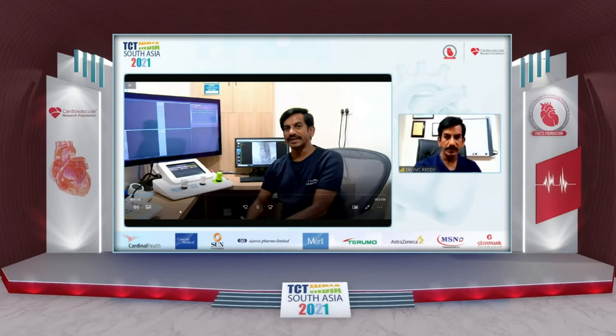Assisted PCI, I would call it a proof PCI, proof for robotic precision, optimization by imaging with OCT, and optimization of physiology with RFR, pressure wire, all robotic assisted. Let us talk about the case.